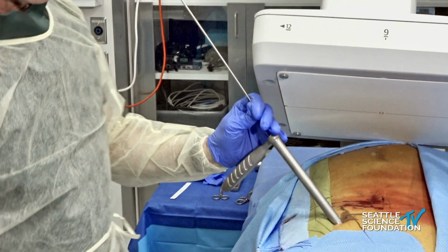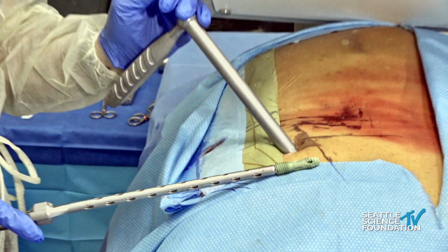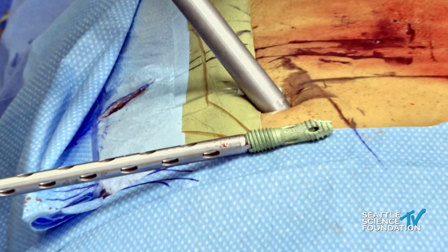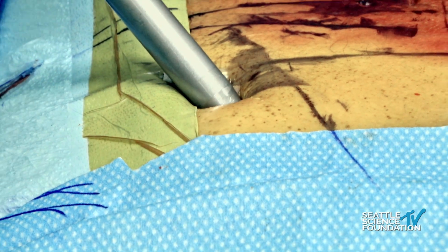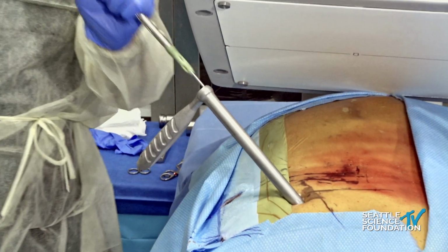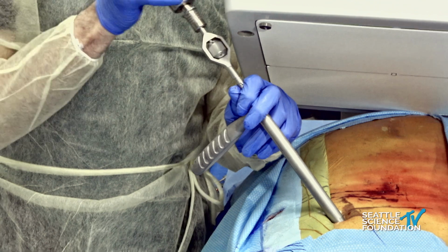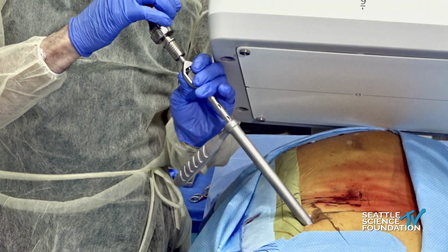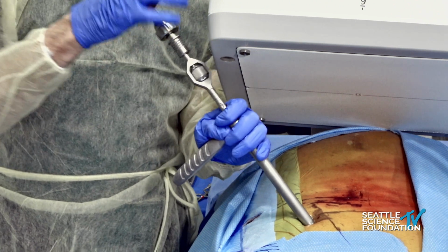And again, I've arbitrarily selected somewhat of an abbreviated size of a screw. This is 45, so this is 11.5 by 45, smaller screw because we might have a little bit of dueling implants going on in there. So this goes on like this, and this is made by Genesis. Genesis has a dedicated posterolateral implant system that you can use with a nitinol K-wire.